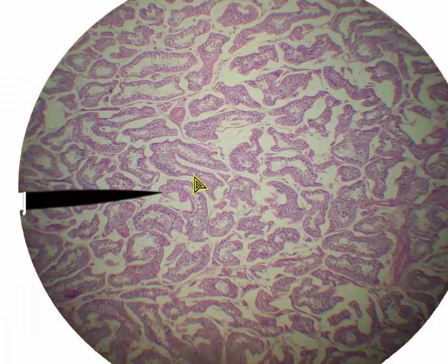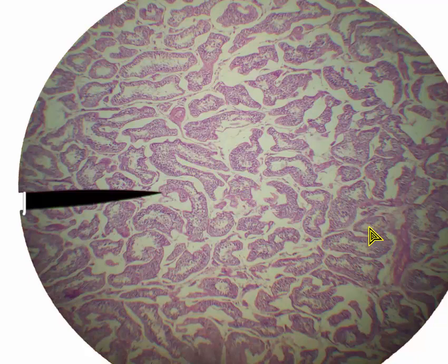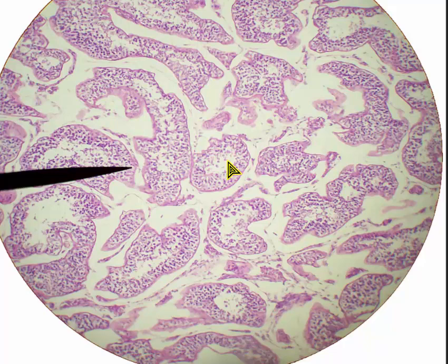This is also testicle, also at 40 times magnification. Again, we see lots of seminiferous tubules — those are the tubes in which the sperm develop.